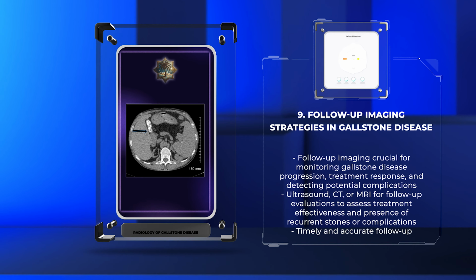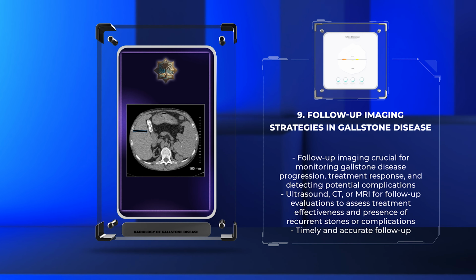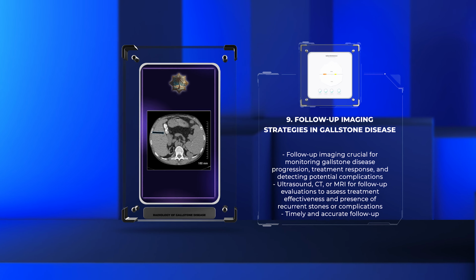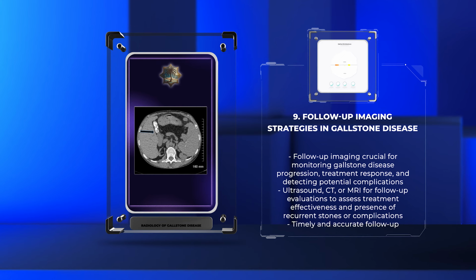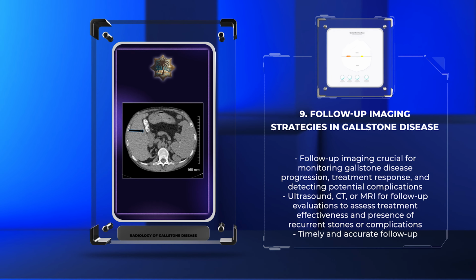Professor, depending on the patient's clinical presentation and previous interventions, imaging modalities such as ultrasound, CT, or MRI may be utilized for follow-up evaluations. These studies help assess the effectiveness of treatment, the presence of recurrent stones, and evaluate for potential complications or recurrent disease. Timely and accurate follow-up imaging ensures appropriate patient management and long-term care. Scene transitions to the title of the next topic.